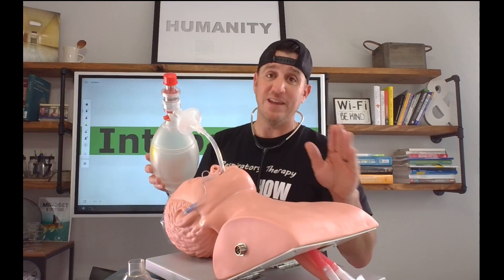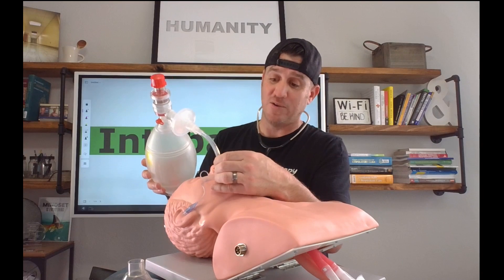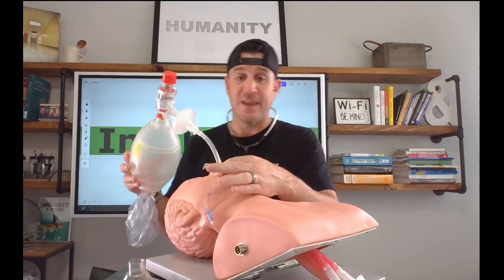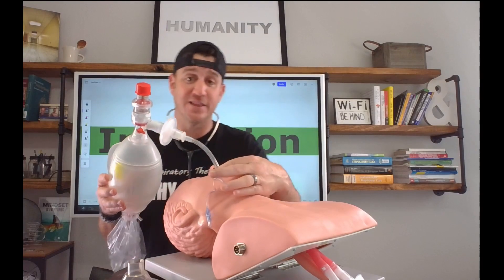Now at this point, we feel good that we're in appropriate position. I'm going to note where this tube is located — this tube is located right now at the 20 centimeter mark at the incisor. So we're going to mark this and secure it at the incisor. I don't have a securing device with me today — that'll be another video for another day — but this is where we are now in the process.